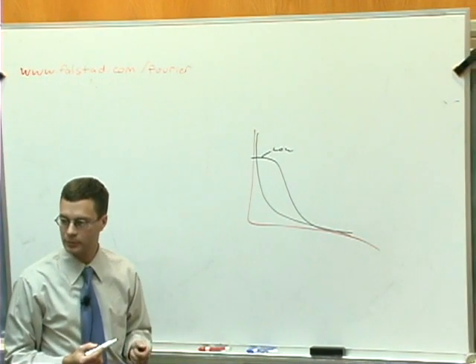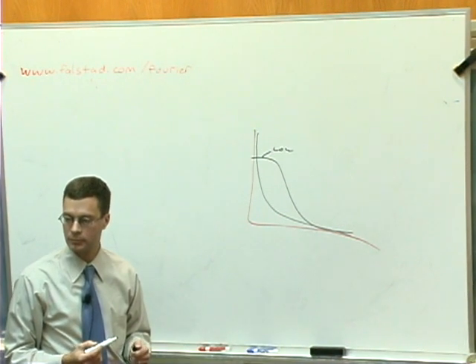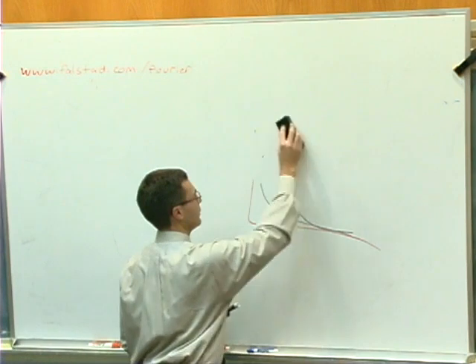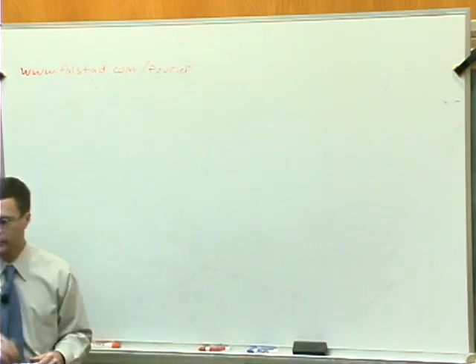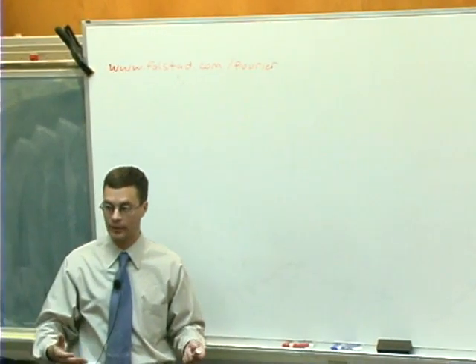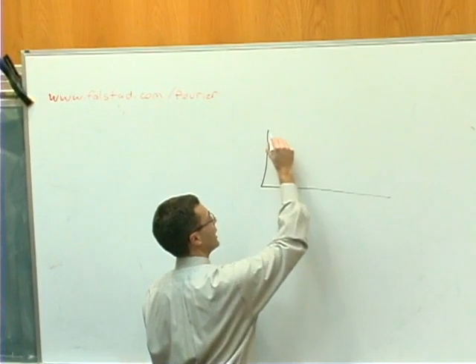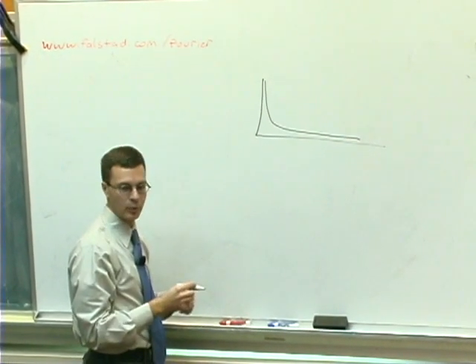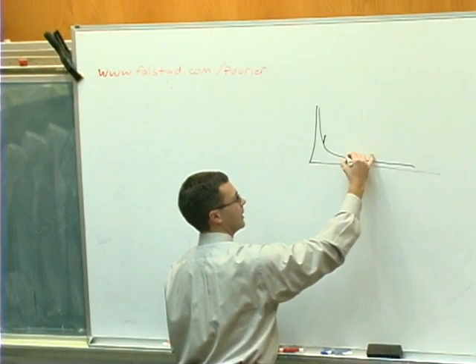Right, but then when you model it, how does the model know what part to attribute to the noise and what part to attribute to the signal? Well, because those two things are not treated equivalently within the model. The role that the HRF plays is in designing your covariates, creating covariates of different shapes. So it might be the case that the model says expect this much noise under the null hypothesis, and then when you actually take a look at the power spectrum of your data, it might have this kind of shape to it.